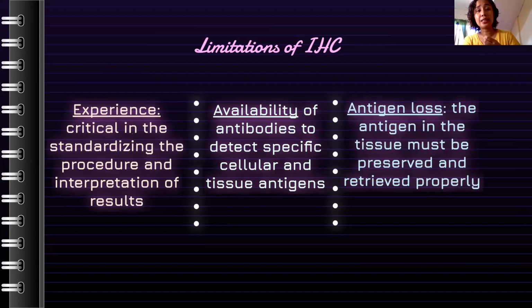And sometimes there is antigen loss, wherein hindi maganda yung pagkaka-retrieve ng antigen. So it's not well preserved or nasira yung antigen that we are trying to find. In your preparation or processing, if nasira mo yung antigen or nawala, it could result in a false negative result. Ibig sabihin, meron talagang cancer, pero since hindi mo na-retrieve ng maayos yung antigen, class, it seems na negative yung pasyente, pero positive talaga. False negative result.